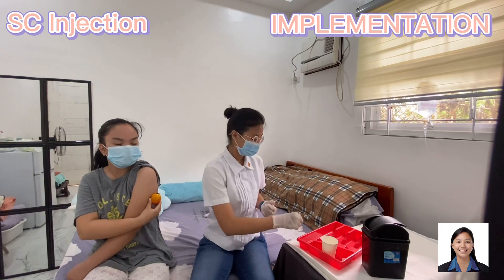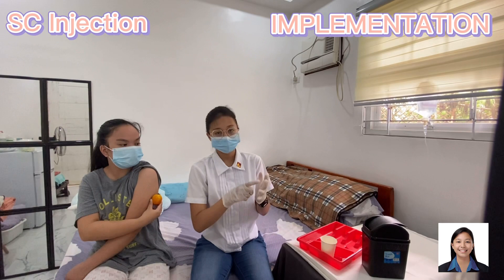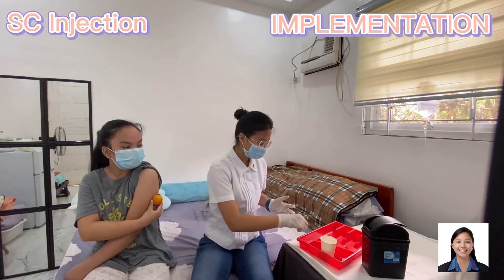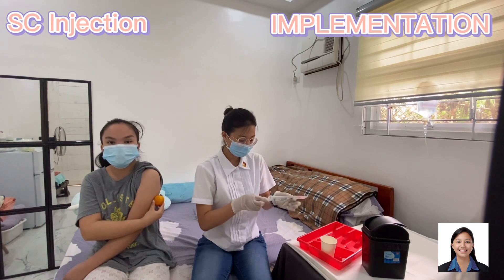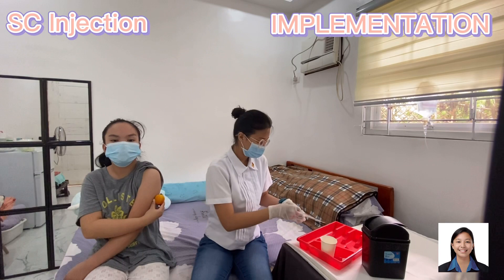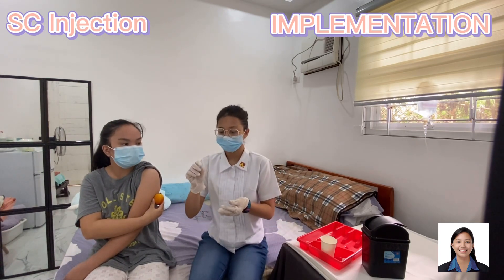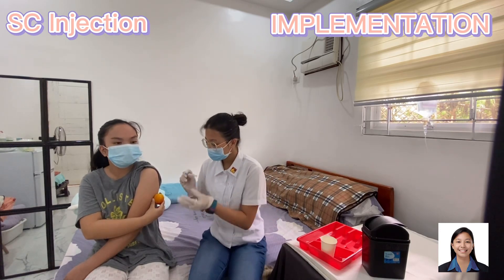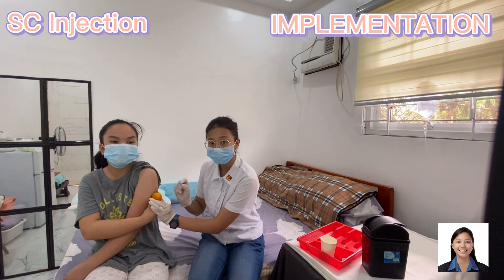Let it dry. Next, hold the cotton ball between the third and fourth fingers of your non-dominant hand. Then uncap the needle. Hold the syringe like a dart with bevel up. Next, pinch the area, then inject at a 45 to 90 degree angle.